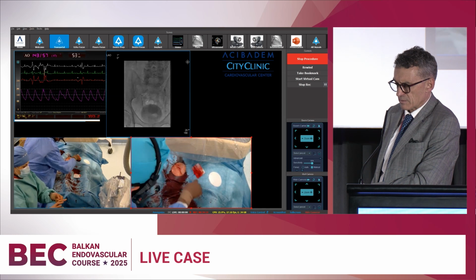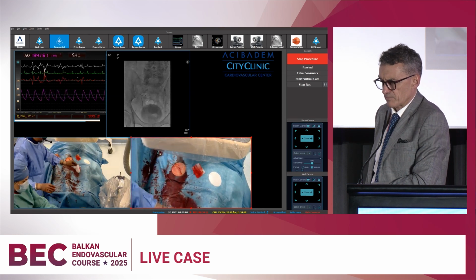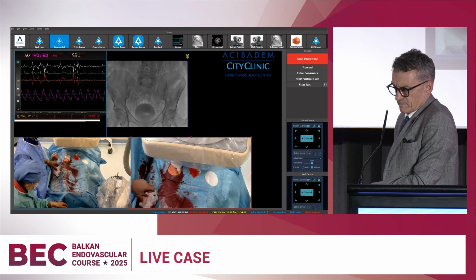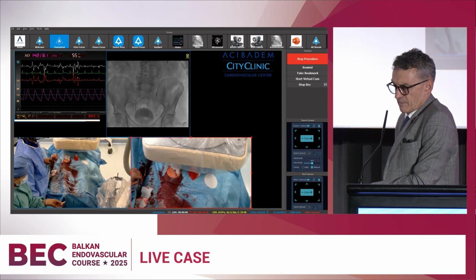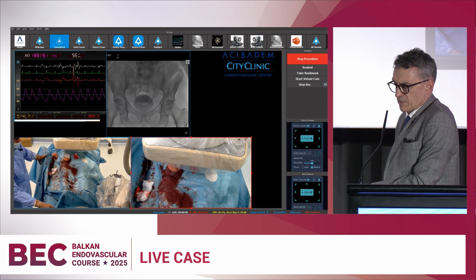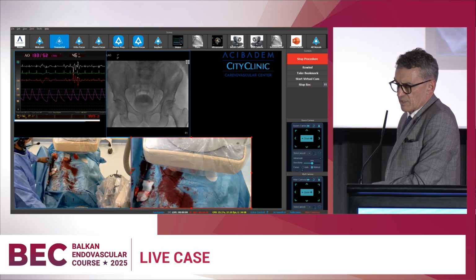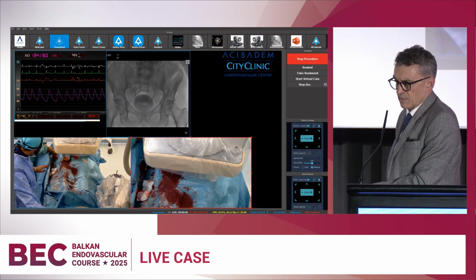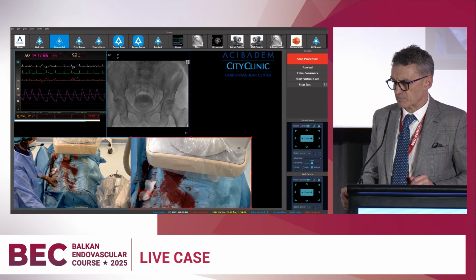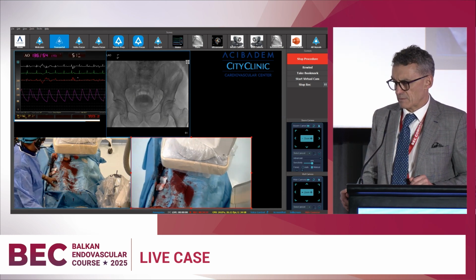Okay, remove all magnifications. Great. Okay. Let us see the iliac artery. Yeah, without magnification, they are going to take a look at everything, the aneurysmatic zone and the zone of vascular access.